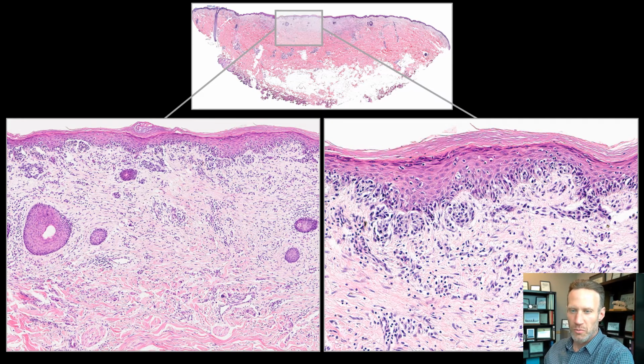Now, this case was used in one of our clinical validation studies, so I've had the chance to study and discuss it with many other dermatopathologists at multi-headed microscopes. And most recognize that there are multinucleate cells along the base of the fibrotic area, and that together with the relatively geometric appearance of the fibrotic region indicates that this is most likely the site of a prior biopsy procedure, and the fibrosis is attributable to that rather than tumor regression, repetitive trauma or friction, or a desmoplastic or sclerosing neoplasm.